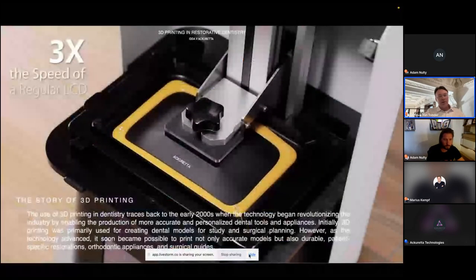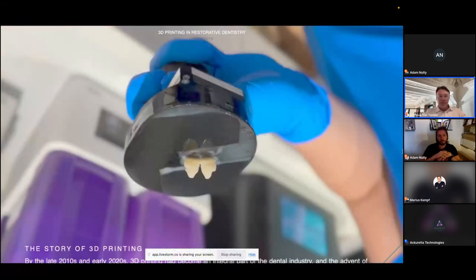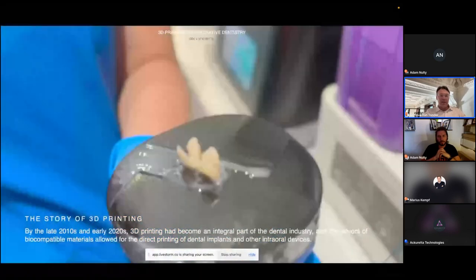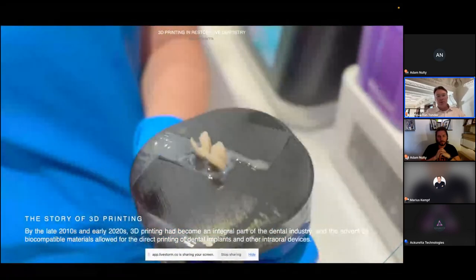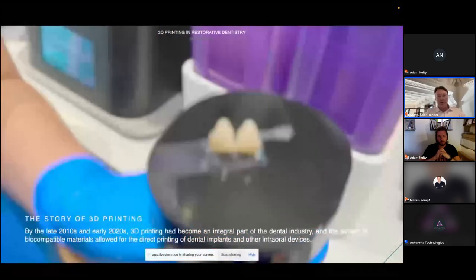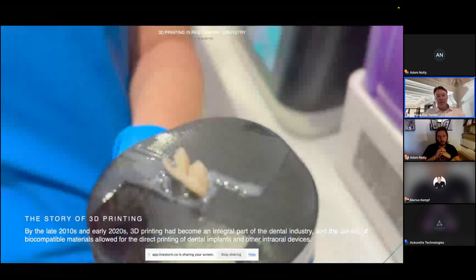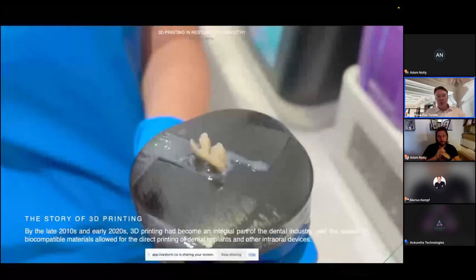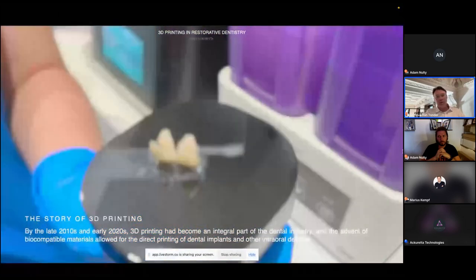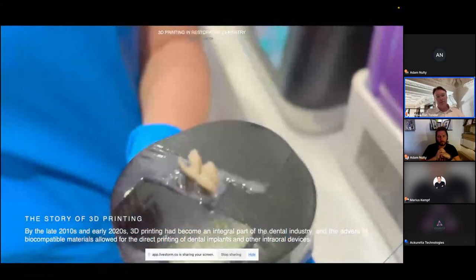And where we are now and where we are going with it is where things have really improved in the last few years: the speed of the printing, the ease of printing, and also the accuracy of our prints. Combined with that, we also have newer materials, biocompatible materials and things like that, that are improving the workflow so that it can become in-house use on an everyday basis.